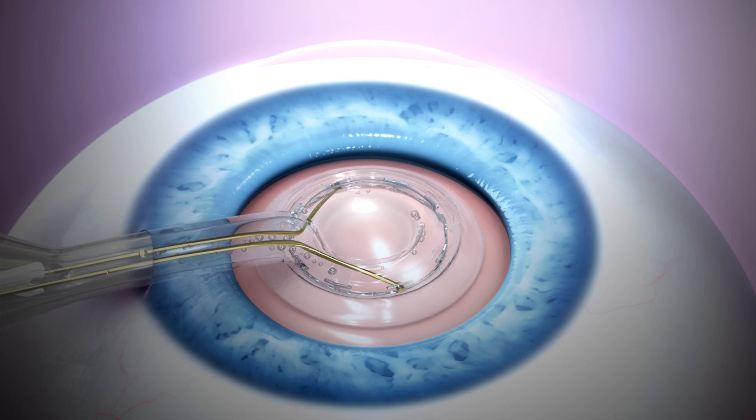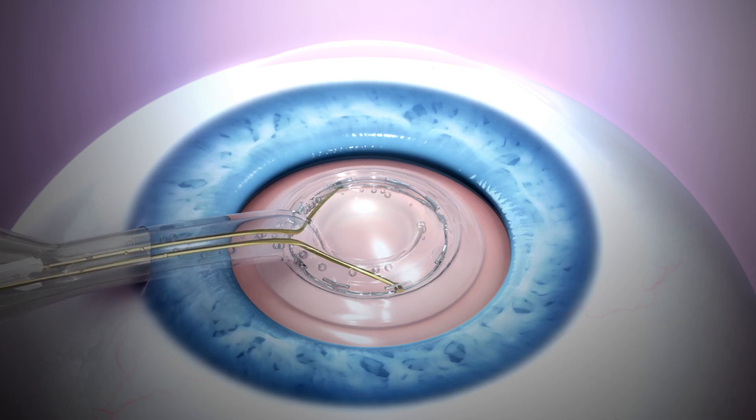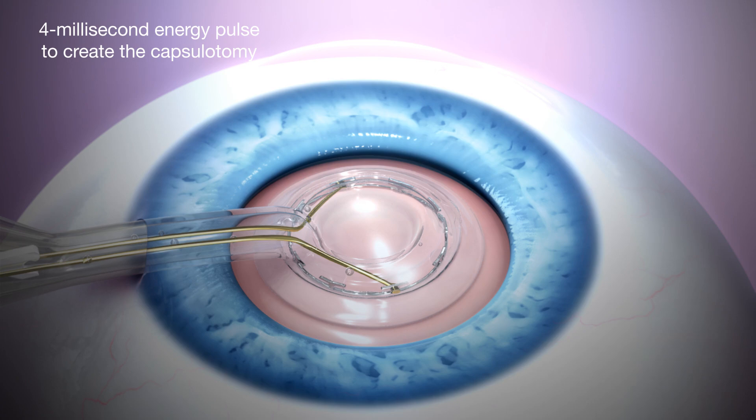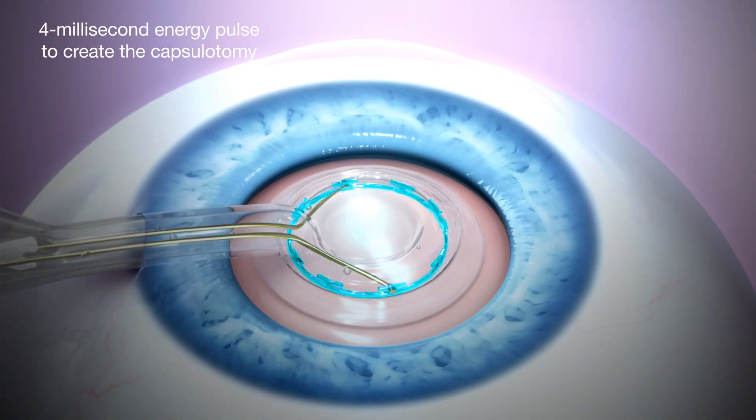Suction is monitored by the flow of small air bubbles in the viscoelastic until it has stopped. A 4 ms energy pulse is delivered to create the capsulotomy.